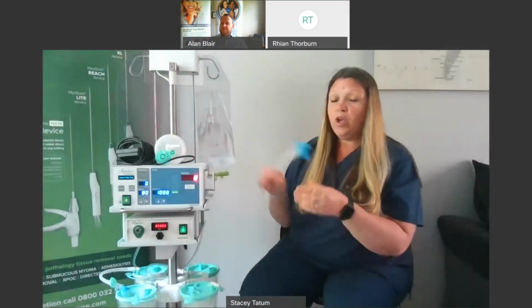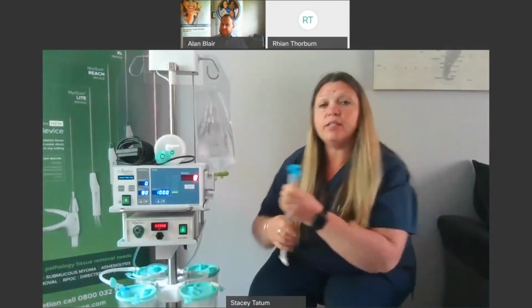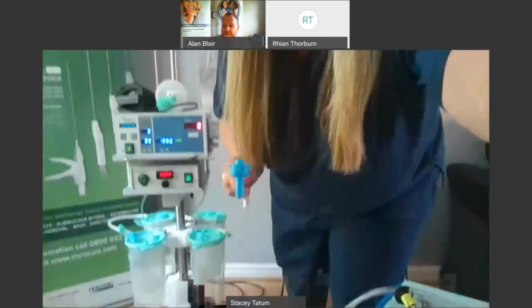If you try to do that whilst it's on the scale, you could push down too hard and crack the scale. Can you just tilt the camera a little bit, Stacey? Sorry, tilt the camera a little bit. Okay. Perfect. Yeah, that's great.